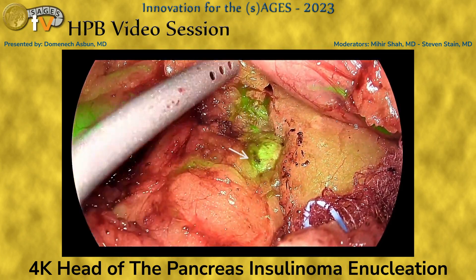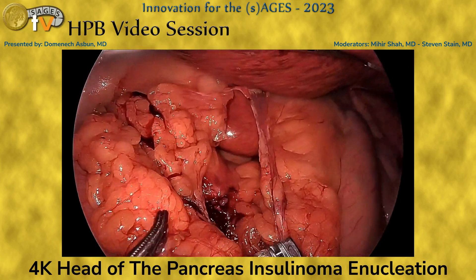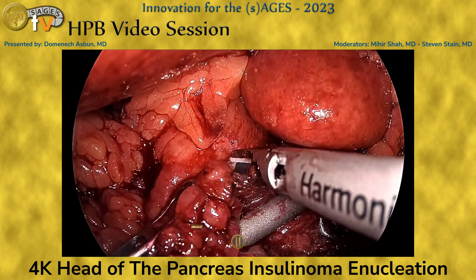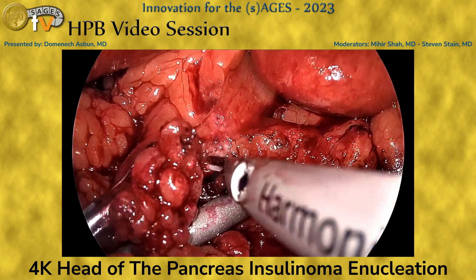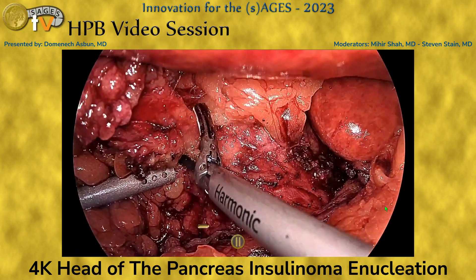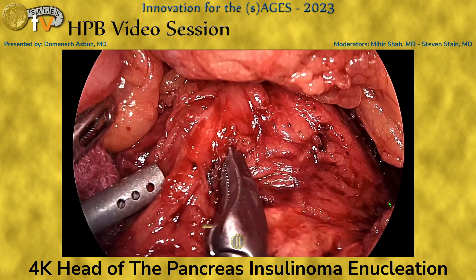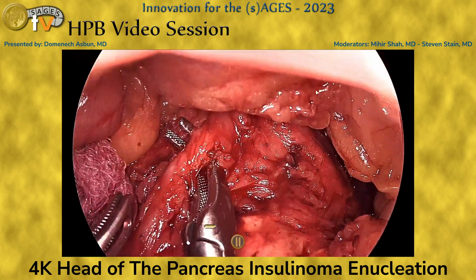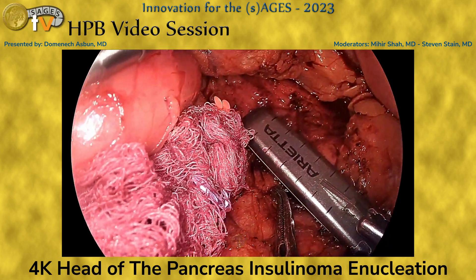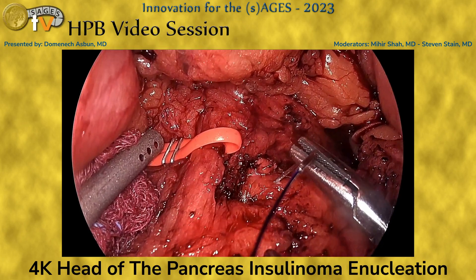We use indocyanine green during a lot of our pancreatic resections in a continuous infusion, which helps us identify the pancreatic parenchyma. This patient had a good amount of intra-abdominal fat, so as necessary we resect fatty tissue to better expose our surgical dissection planes. Here is the GDA — we encircle it with a vessel loop, use ultrasound to confirm it is the GDA, and check flow in the liver when it is occluded.